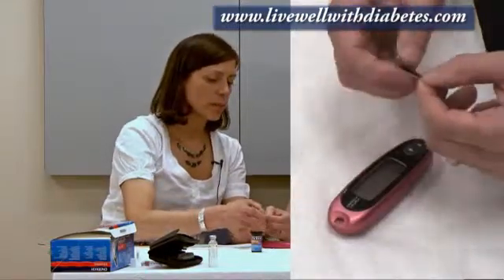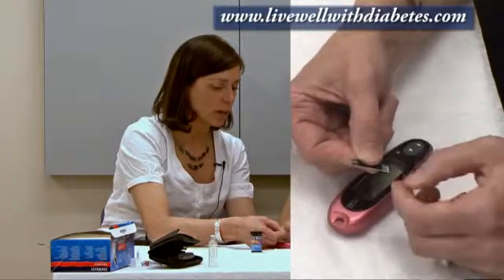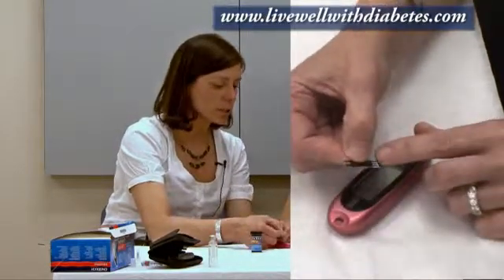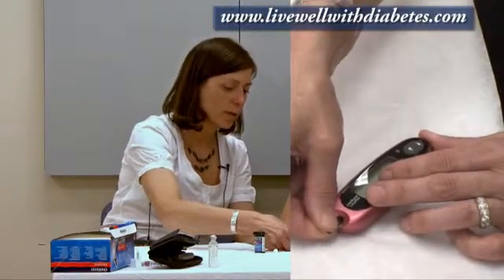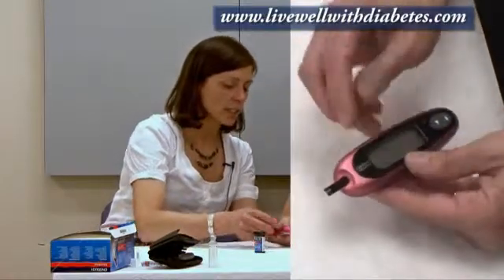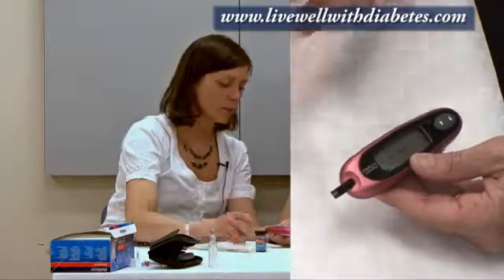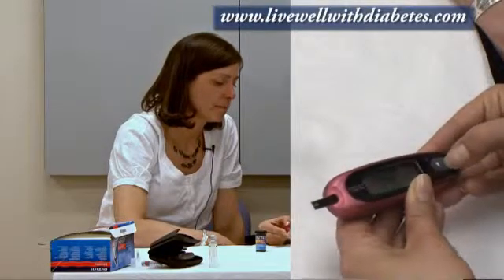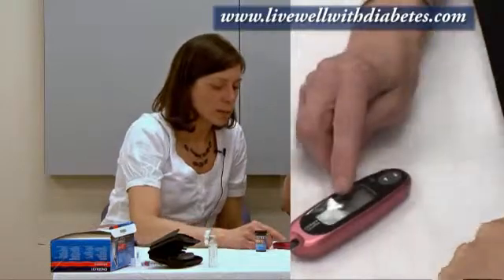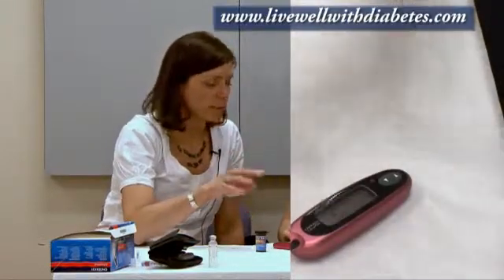For this particular meter, you do need to tell the machine the code number to get the most accurate value for your blood test result. Some other machines on the market have deleted that step and no coding is needed. For this one, when I take out a test strip, you can see this end has a striped end and this other end is where the blood's going to go. When I push the striped end into this area here, that automatically turns the machine on. I push it in all the way and the screen lights up. It says 'C dash dash' — it's waiting for me to put in the code number. If I push the arrow button, it changes the number. Push the button to get it to number 22. That number flashes a couple of times and then stays set in the memory. The next screen shows a drop symbol, meaning it's ready for your blood sample.